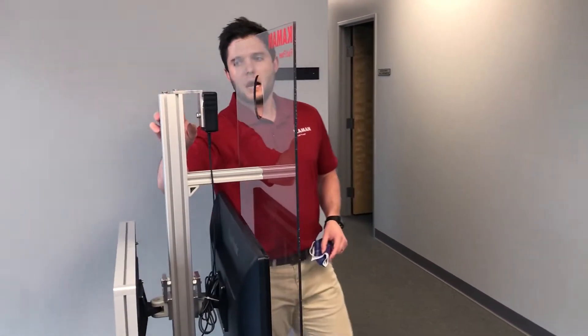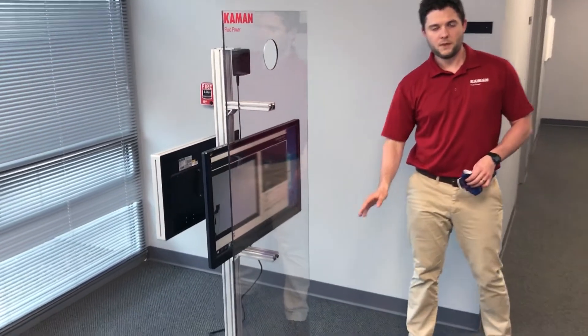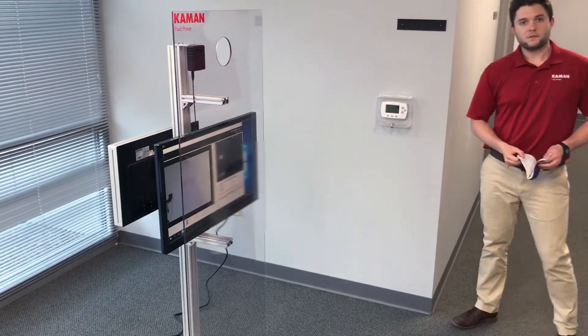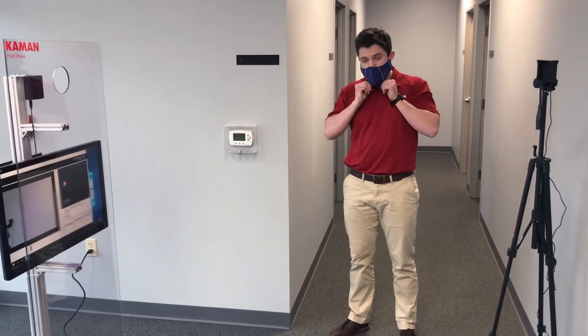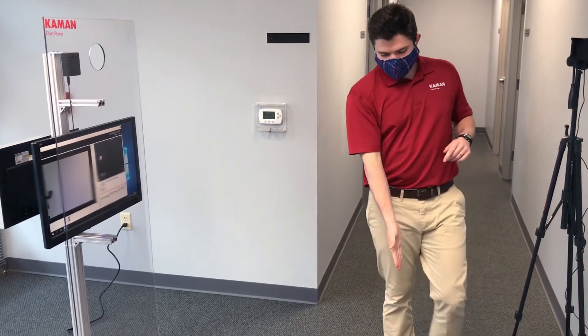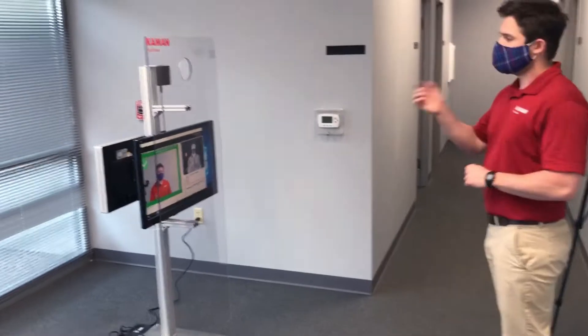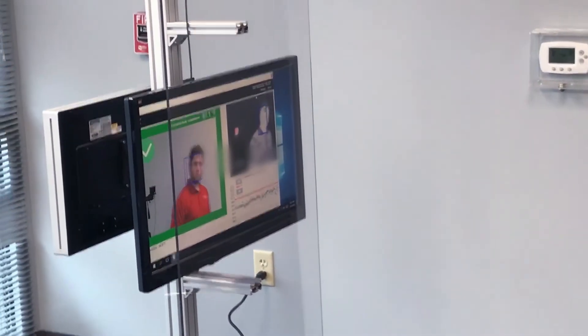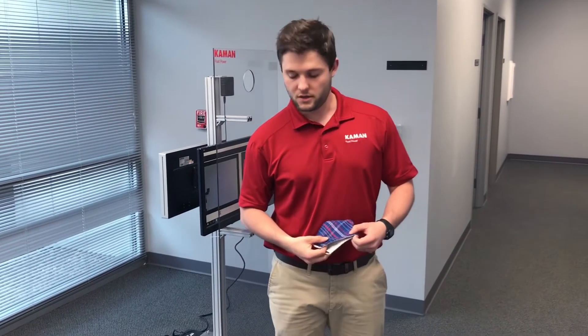This is all mounted on top of an aluminum cart with casters on the bottom for easy mobility. I'm going to show you what the process of the screening looks like. Employees have their masks on, they remove their eyewear, and they step on a spot measured out five feet from the camera and get screened. I just showed 97.1 degrees Fahrenheit — not feverish — so I move on and start my shift.